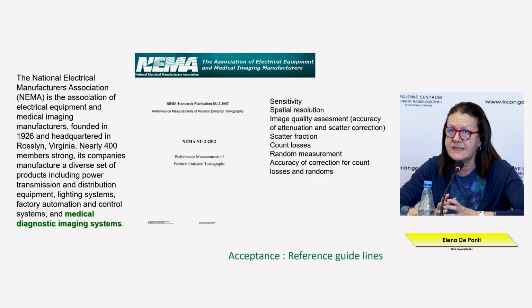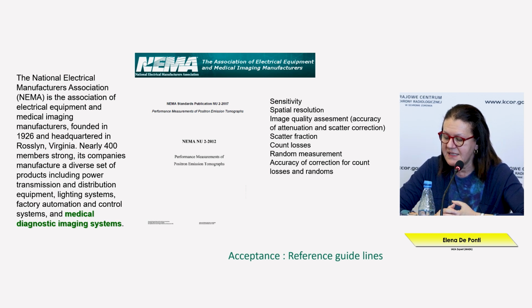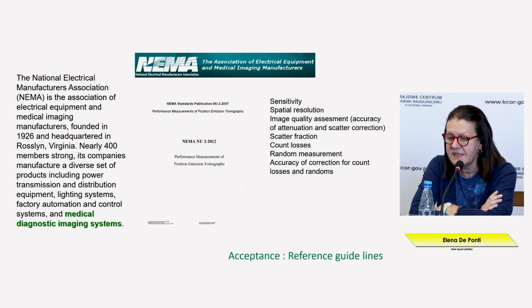NEMA is an association in which we have all the vendors. These guidelines are produced for different types of medical equipment, but in our case we are considering the NEMA guidelines for PET-CT scanners, and they give a list of parameters and evaluations that have to be done to completely describe one piece of equipment.